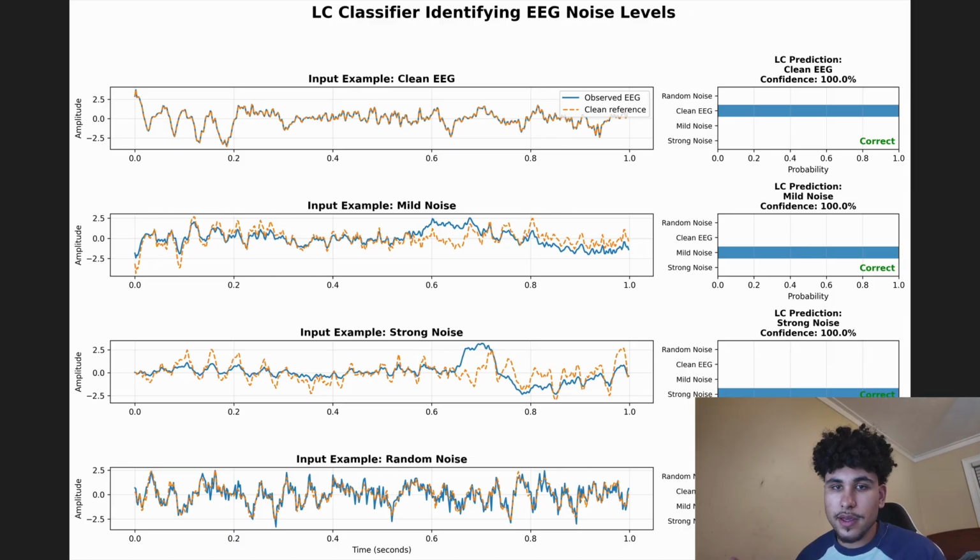So as you can see in this graphic, there's 4 types of EEG data: clean, mild, strong, and random levels of noise. In this case, the blue line represents the noisy or corrupted EEG dataset, and the orange line represents the clean EEG data. Each type of data is fed into the LC model, and then the LC will predict what level of noise is on the dataset. If you take a quick look at the right side of the graph, the LC runs a prediction and gets clean for this clean EEG dataset, it gets mild for this mild dataset, and so on.